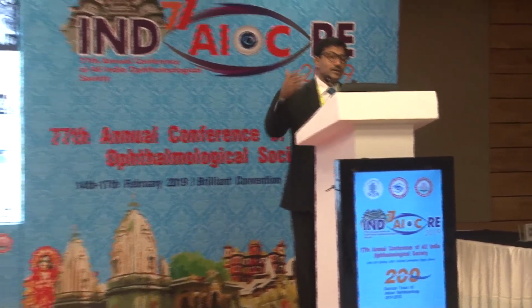So to me, what is more important than the film itself is the CD that the patient brings along, and you should probably have an image viewer where you're doing real-time millimeter by millimeter analysis of axial, coronal, sagittal, as we'll show later. And finally, the data which comes on a CD or a thumb drive is what is going to be useful for your treatment planning. And if and when you're going to do navigation, you can use that as well. So these are examples of cuts I'm going to show you over here.